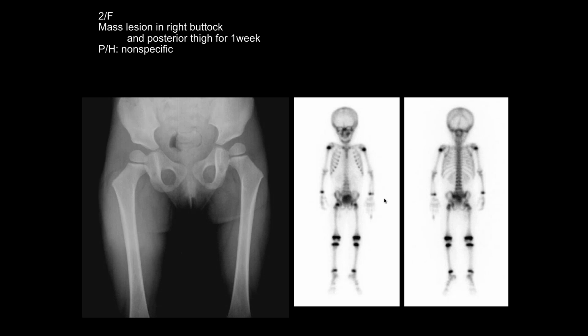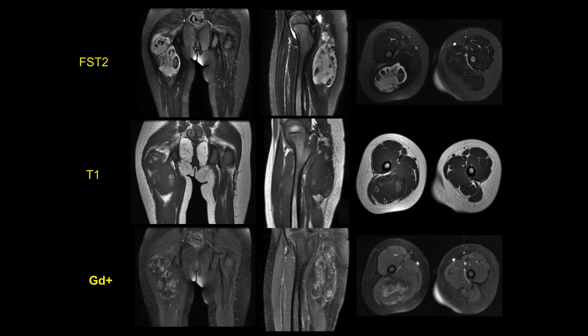I'm not seeing anything particular on the plain radiograph. Let me take a look more carefully. Yeah, I'm not seeing much there. So, okay, we've got MR. So no uptake on the bone scan either. So now we're looking at FST, T1, and post-contrast.